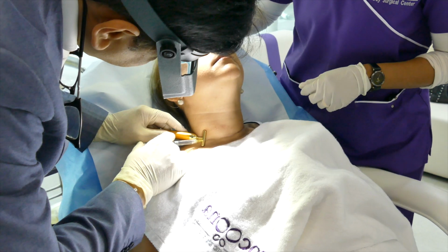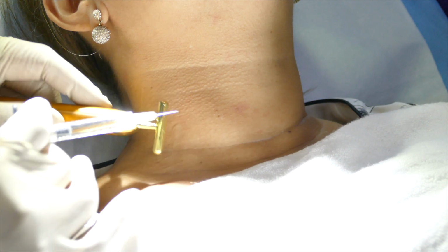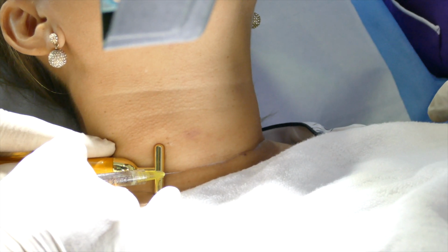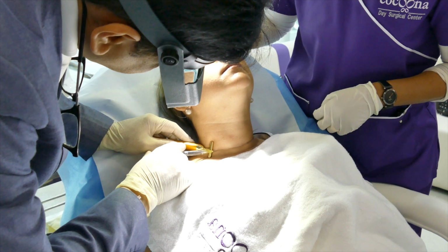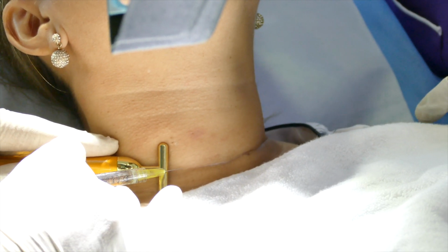Fillers can be used to treat neck creases as well, the deep neck lines, but the word of caution is to use a very fine filler because it can show as lumps which can last for very long, and to inject just intradermally and subdermally all along the crease line.